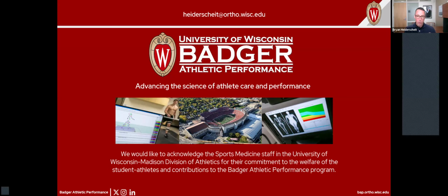Again, I think the important part will be the post-processing element, as you saw from the talk. There's an aspect of capturing it at point of care and capturing it well. And then there's also the need to be able to quantify it. It can be done in that post-processing manner using the bone tracking algorithms.